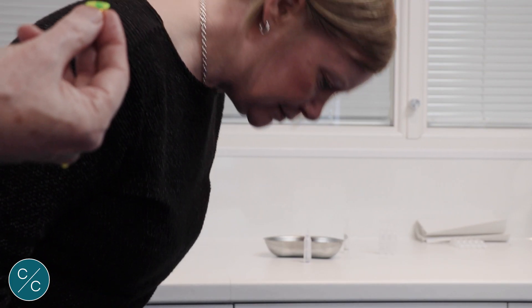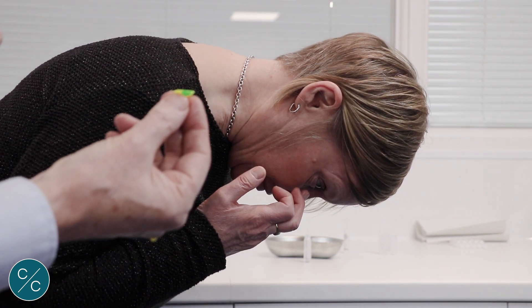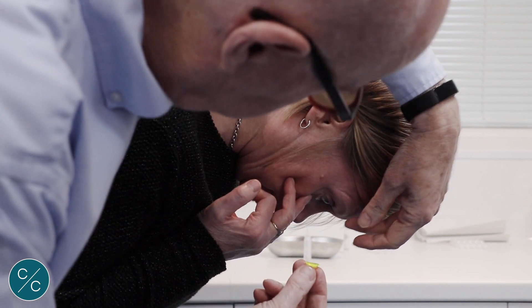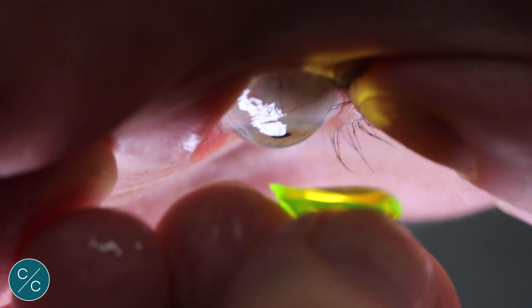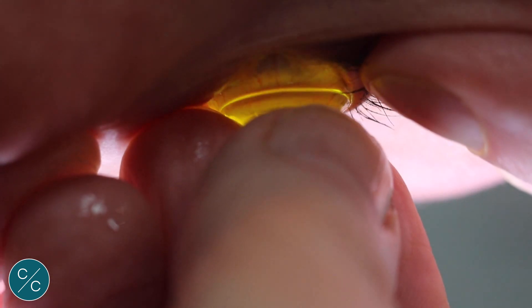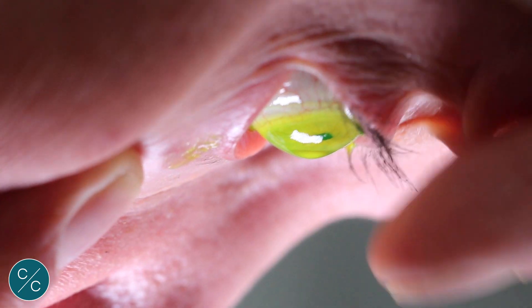Okay, so we'll get you to lean forward about 45 degrees from the waist — that's good — chin down to your chest, pull your lower lid down with your middle finger. I'm going to lean over and hold your top lid out of the way and here comes the lens. I'm going to rest on your hand and you'll feel the cold of the solution. Then a gentle press as the lens goes on, put my hand away and the lens is in.